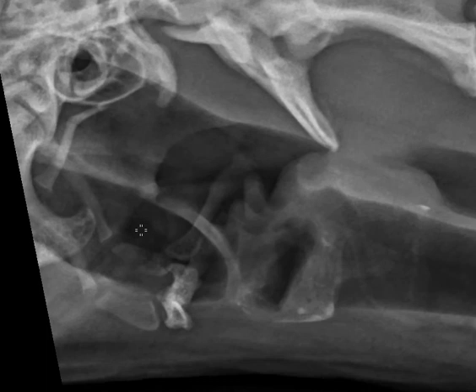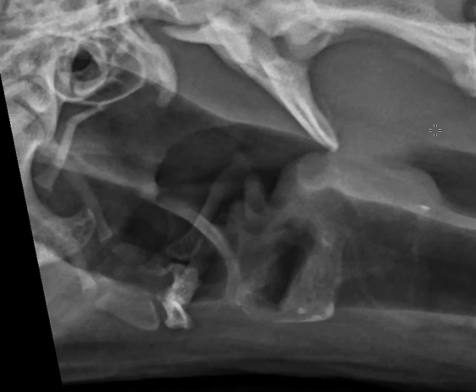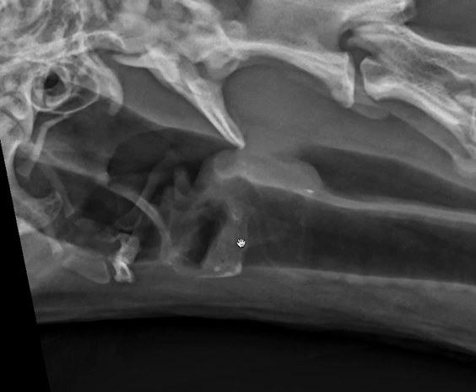The rostral part here is going to be the pharynx, and that leads us into both the larynx, which we've already looked at, and dorsal to the larynx, through this soft tissue opacity on the dorsal aspect of the cricoid cartilage. This soft tissue summation here is our cricopharyngeus, or upper esophageal sphincter, leading us into that gas-distended esophagus. I hope that our tour through the larynx will be useful for you the next time that you have to look at a case where you're wondering if there could be a mass or even a foreign body in this region.